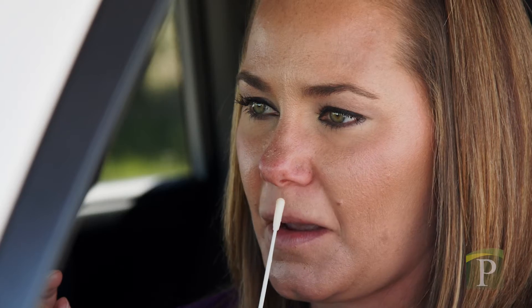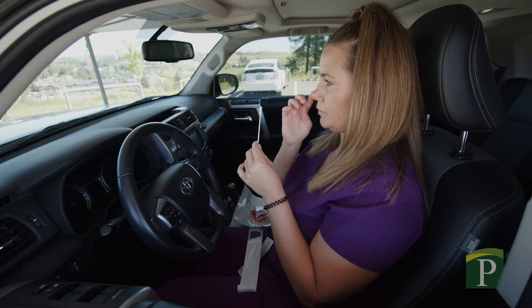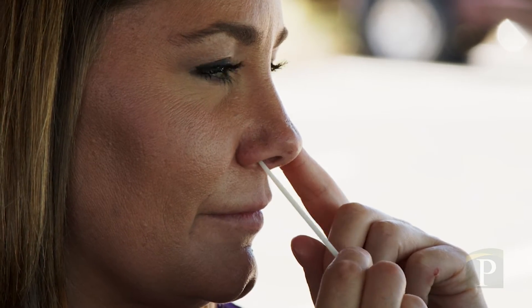Place the end of the swab into your nostril. It only needs to be inserted to about the middle of your nose. Swirl it around inside 10 times, then gently remove it. Repeat using the same swab in the second nostril, counting to 10 each time.